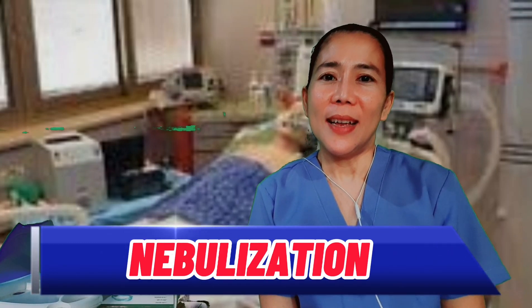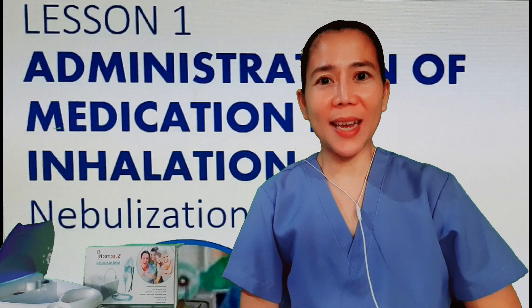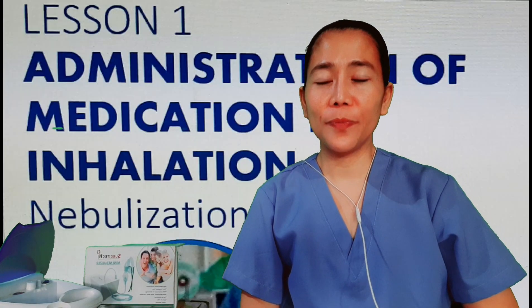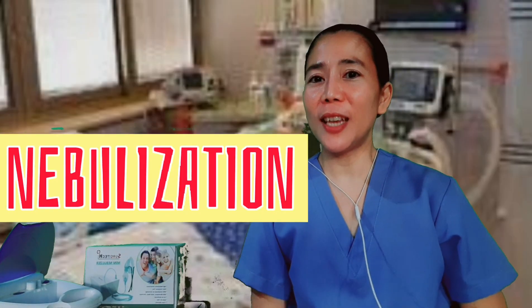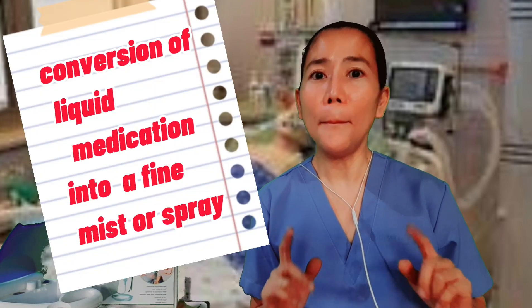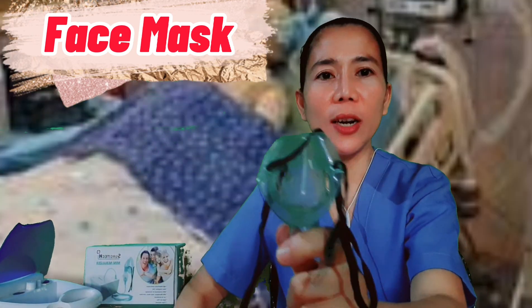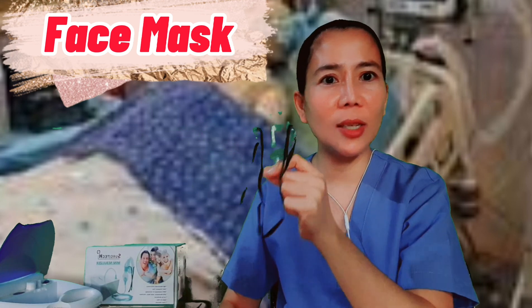What I will be sharing with you today is about nebulization. It is part of our lesson one: the administration of medication by inhalation. Nebulization is simply a conversion of a liquid medication into a fine mist or spray so that a patient can breathe it directly into the lungs via face mask. This one is for adults and this one is for kids — that's why it's smaller.